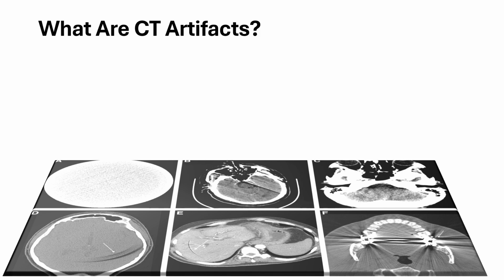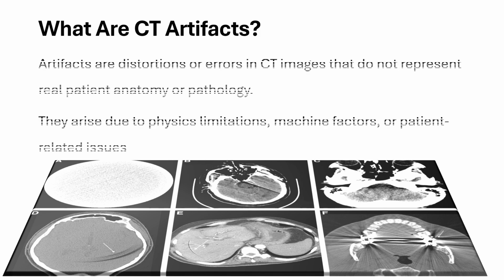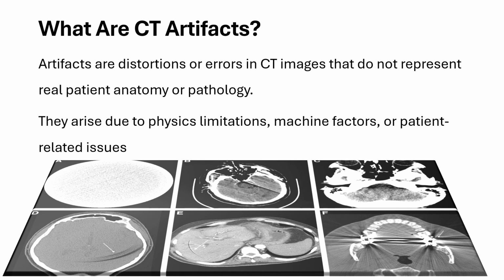So what are the CT artifacts? CT artifacts are the distortion or errors in CT images that do not represent real patient anatomy or pathology. So they arise due to the physics limitation, machine factors, or patient related issues.